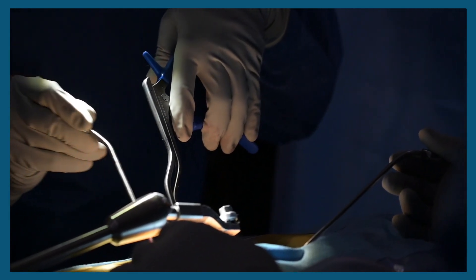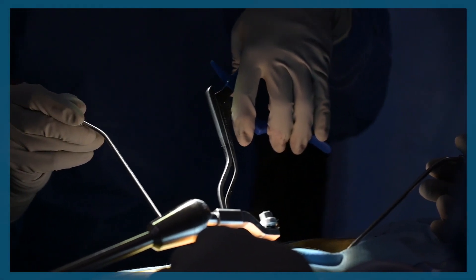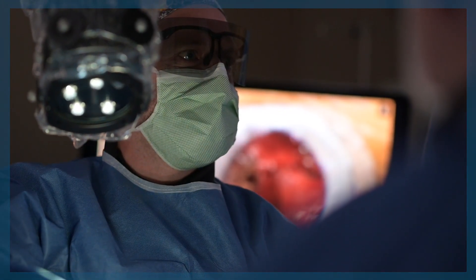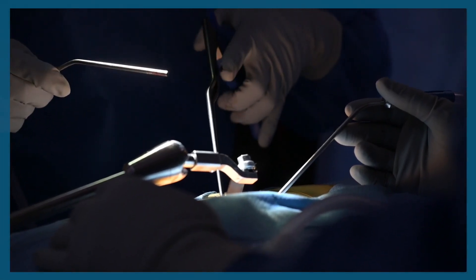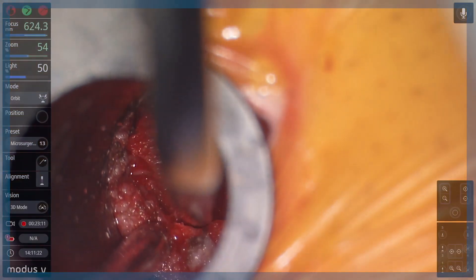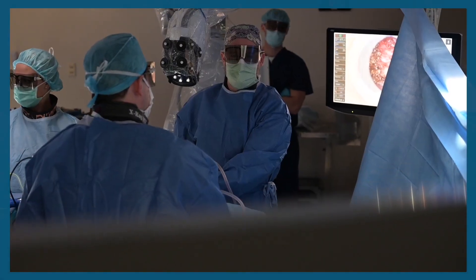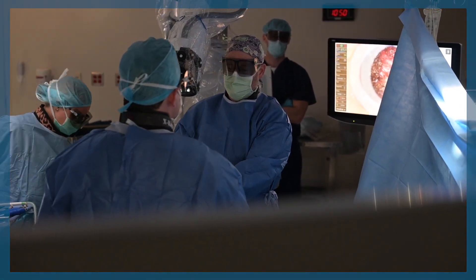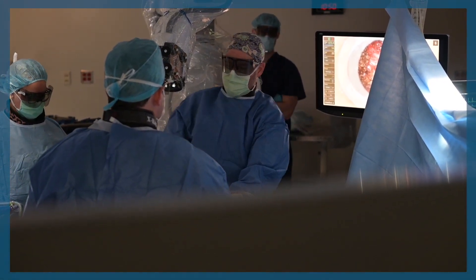The exoscope allows you to zoom in with higher definition than the regular microscope, in my opinion. You're able to see different angles that you would have a lot of trouble seeing with the traditional microscope. You're able to easily move the exoscope around in different angles in your operative field with a robotic arm attached to the exoscope. You're able to put a pointer down into the field and point exactly where you want to see, and the exoscope will move into that line of sight. The exoscope will store different positions, so you can say that you want to look more medially or laterally, and the exoscope will move into that position.